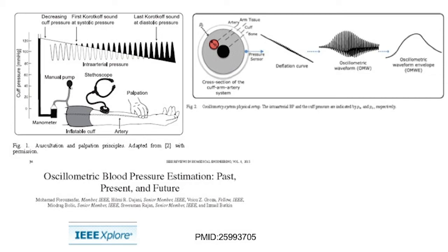These are examples of oscillometric devices, a home one, an office heavy-duty one, and an out-of-office ambulatory one, just 3 examples of the oscillometric technique. What most people don't realize is that there's a heavy-duty set of electronics behind these things that have developed greatly since the 60s when these things first started coming out.